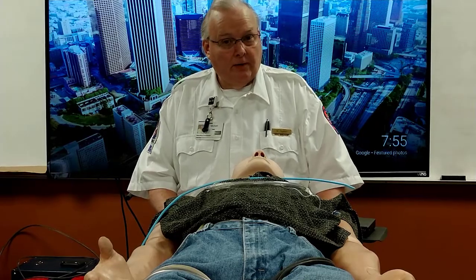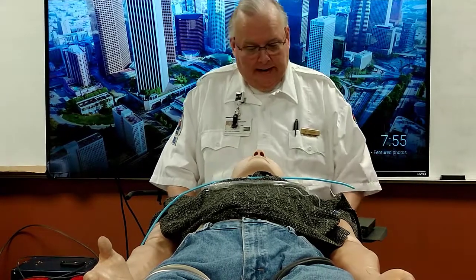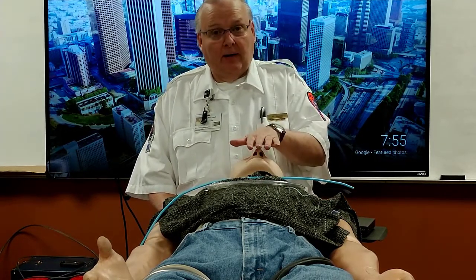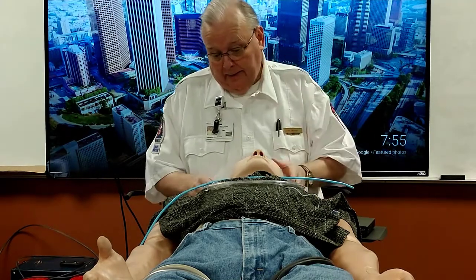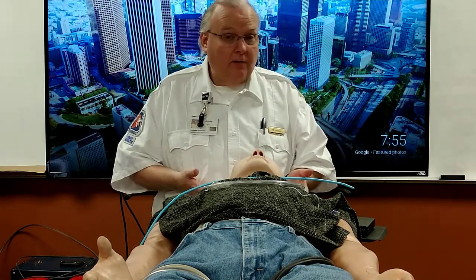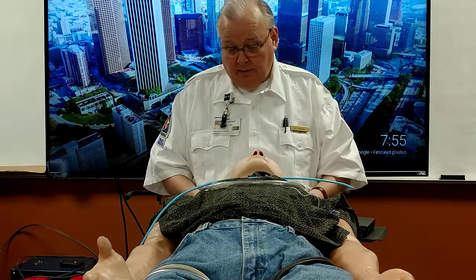With positioning the patient, one of the things that's very easy to do, the best positioning for the patient is that the patient's face is on a level plane with the ceiling, and that the tragus of the ear is at the same level as the sternal notch. You can do that by putting a blanket or a couple of towels under the patient's head like I've done here.